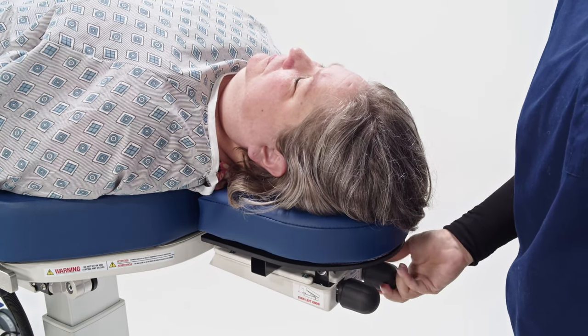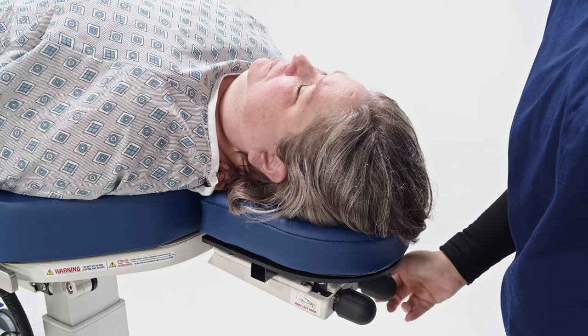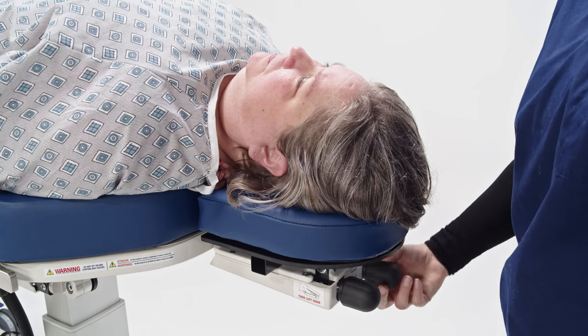The right knob aids in the head tilt. Clockwise movement moves the head downward, while counterclockwise movement moves the head upward.